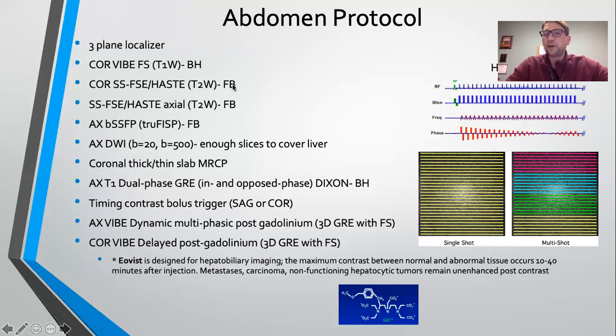This is what we call free breathing, because we're allowed to image while the patient is breathing. So very rapid imaging. Half Fourier just basically means you fill half of K-space. And remember, K-space is symmetrical, so if you fill half of K-space, you can just replicate the data from the top and fill in the bottom. So it speeds it up even more.